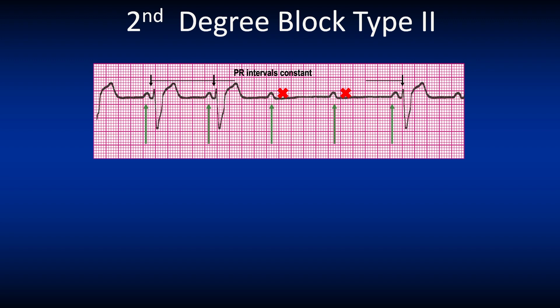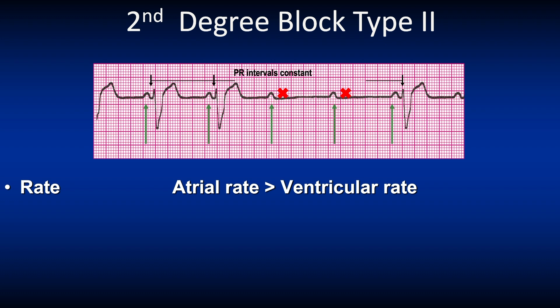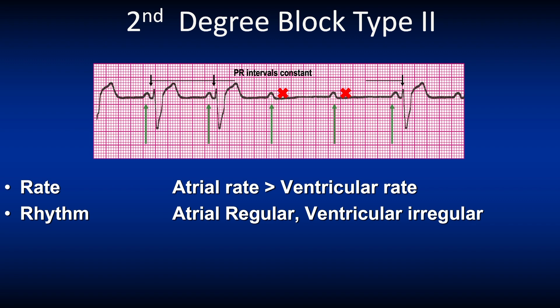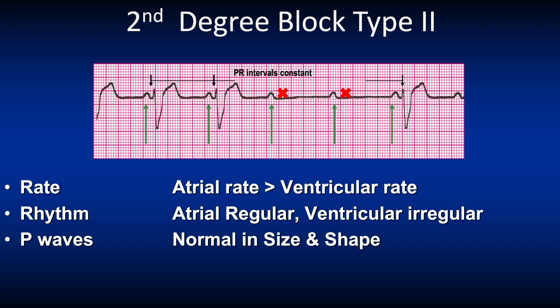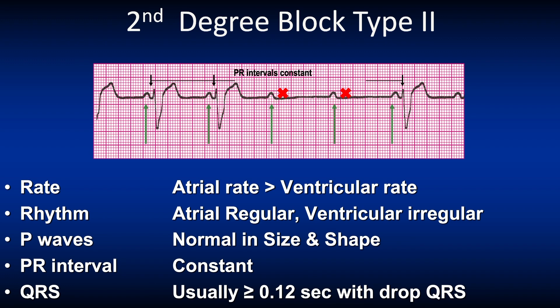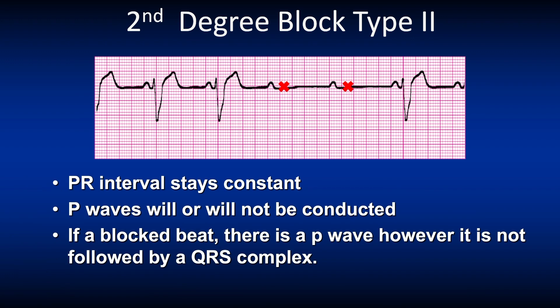Here we see a second degree block type 2. The atrial rate is more than the ventricular rate. The atrial rhythm is regular versus the ventricular rhythm, which is irregular, as there are dropped beats. The P waves are normal in size and shape, and you'll find more P waves than QRS complexes. The PR interval is usually within normal limits but can be prolonged, and it stays constant until there's a P wave without a QRS complex. The QRS is usually three small boxes or more, with some dropped QRS complexes. On this ECG we see two P waves without a QRS complex. The key to remember is that the PR interval will stay constant until you have a P wave without a QRS complex.